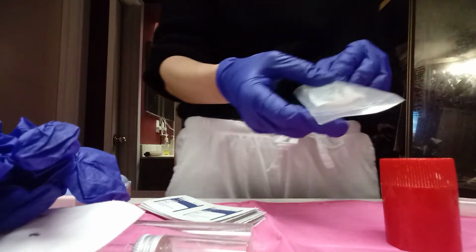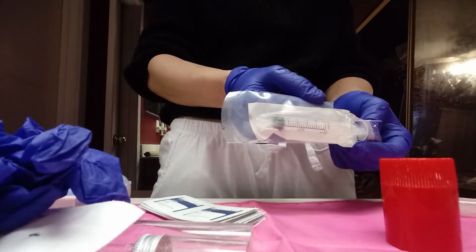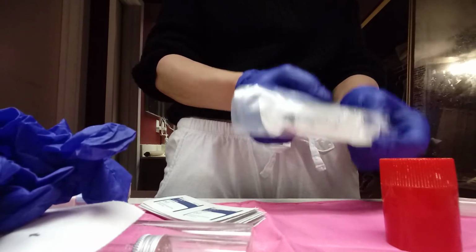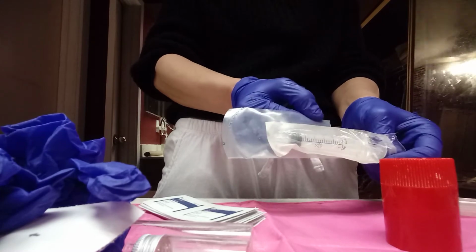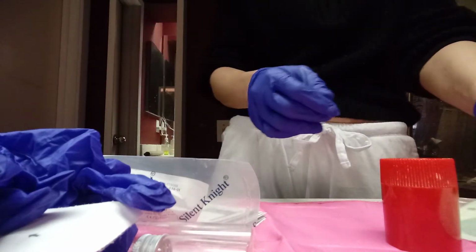This is another important thing. Now this is what controls the water in your balloon. Okay? If you are taught by your doctor to use this, bring it with you. If it gets loose, you can add water to the balloon and just move on. No big deal. Okay? I don't want to make this too long, but this is the most important part.